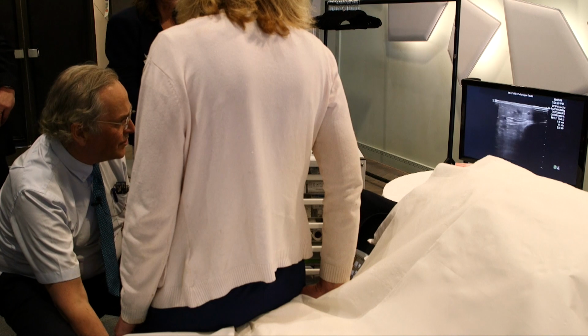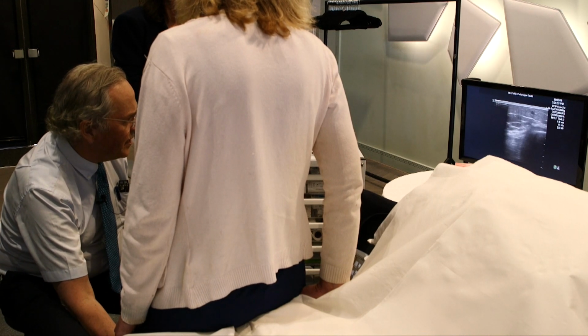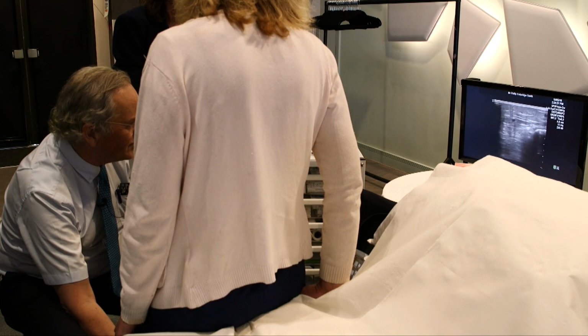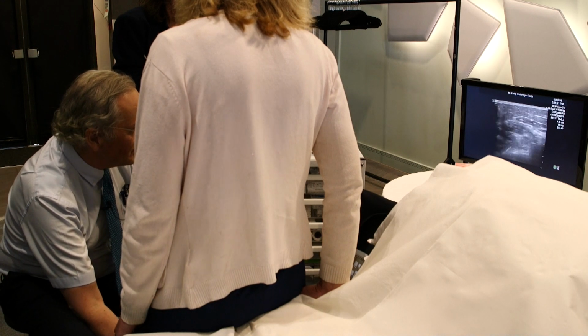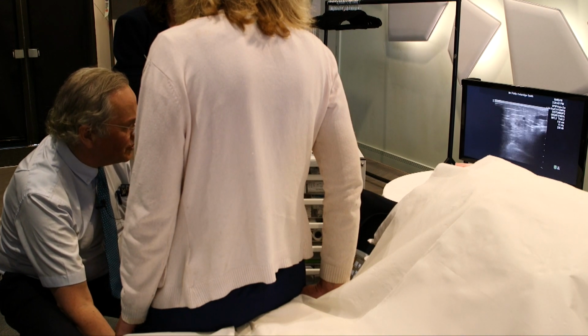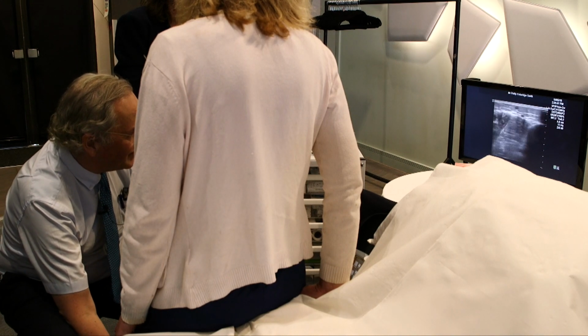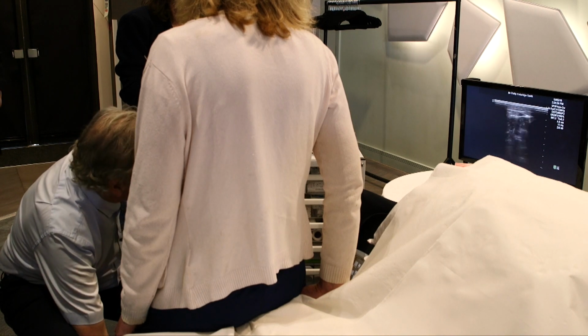There are the varicose veins I'm complaining about. But you can see, and they join onto the saphenous vein. So there's the tibia just on the right of the picture. And that's the saphenous trunk, not a very big saphenous trunk, but the varicose veins join onto it. So I'm planning to inject the saphenous vein and perhaps the varices as well.